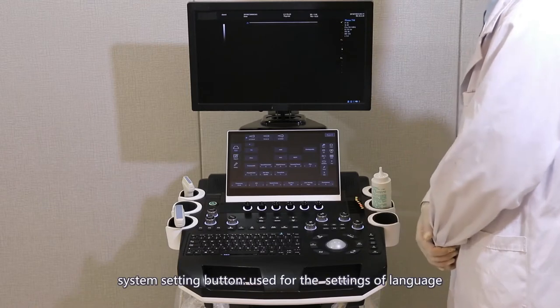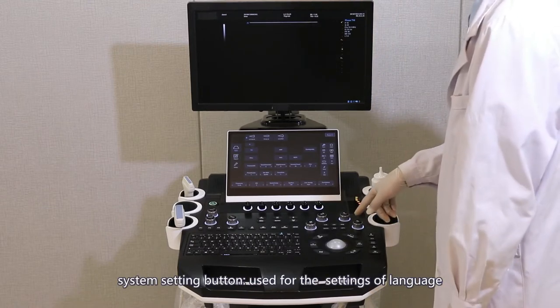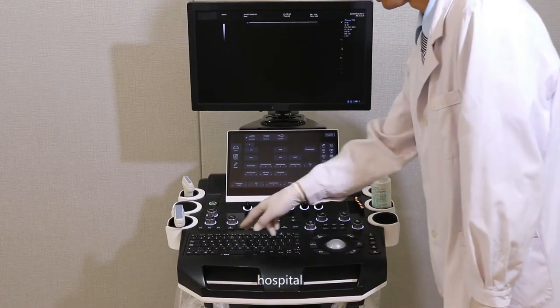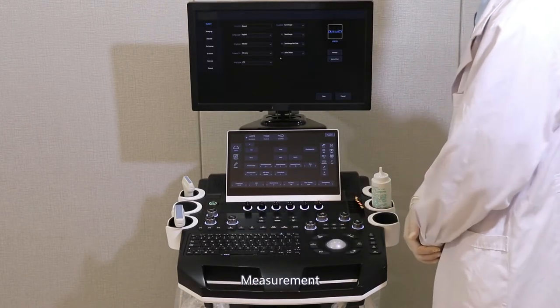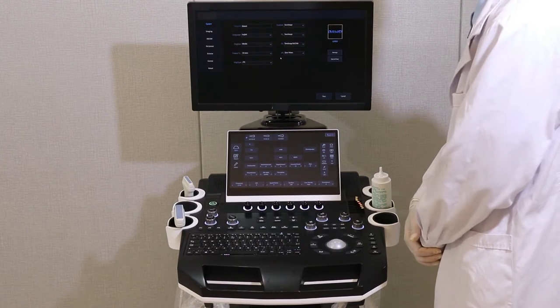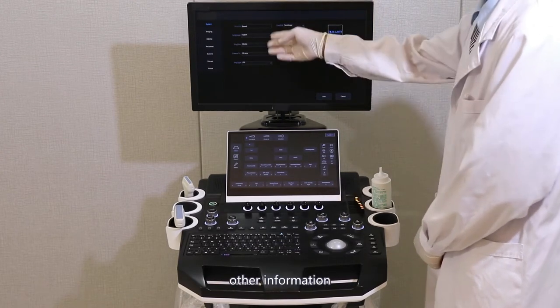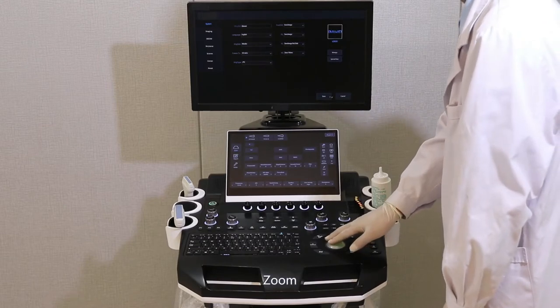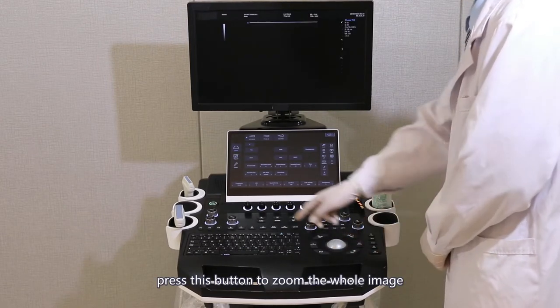System setting button: used for the settings of language, hospital, measurement, and other information. Zoom: press this button to zoom the whole image.